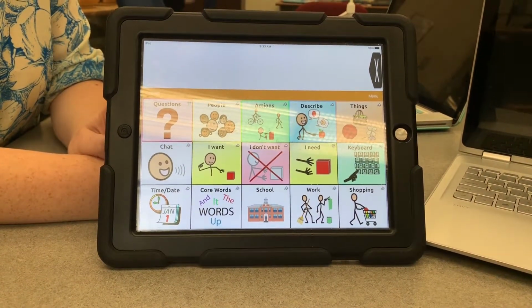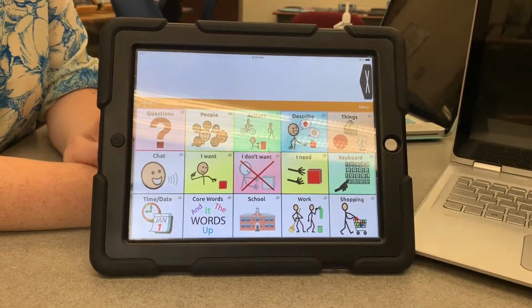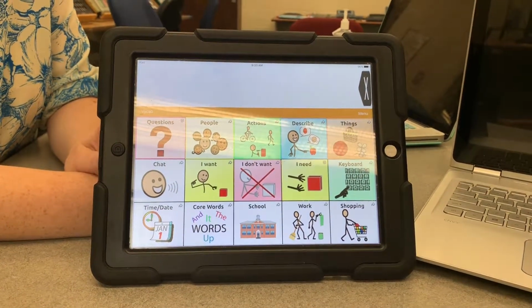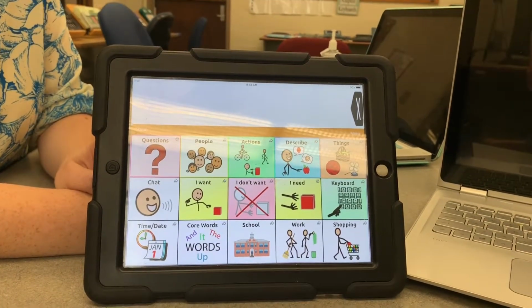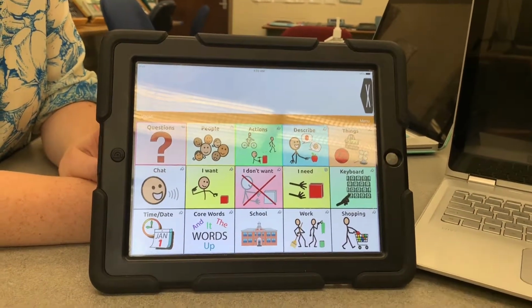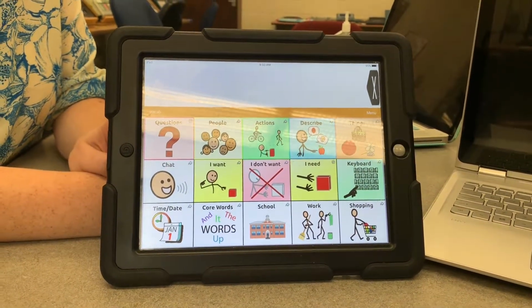There are many accessories available online and in stores for iPad. It can be overwhelming to see the variety of accessory options and try to understand how they can improve a user's experience. So users or families may want to discuss with someone on their AAC team what would be the most appropriate accessories for the users and their needs.